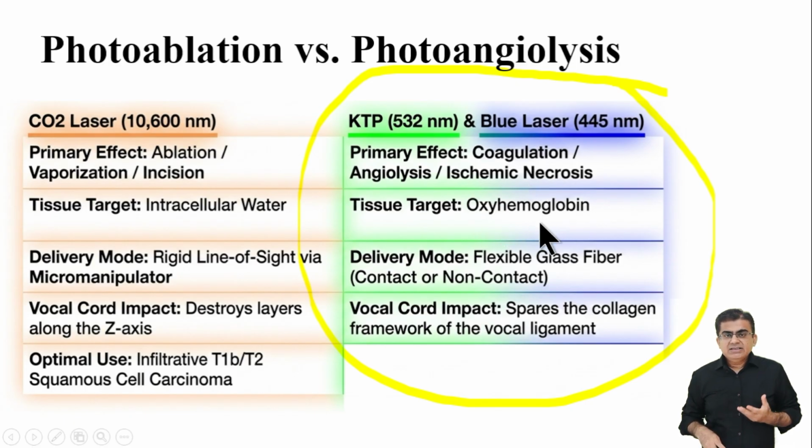Instead of cutting, they cause highly targeted coagulation and photoangiolysis. This specific action safely starves the tumor of blood and causes ischemic necrosis.